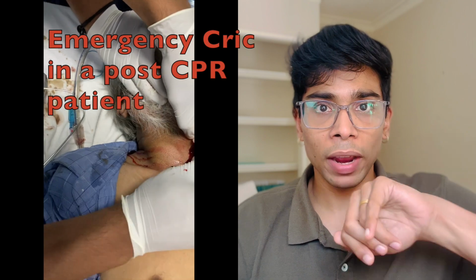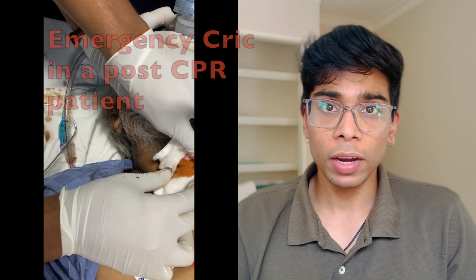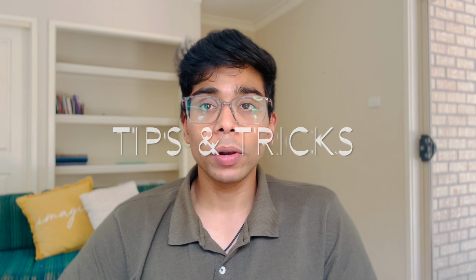So once your finger is in and you confirm that you're inside the trachea, you pass a bougie along your finger into the trachea. It's very clear. You hear the tracheal clicks, and once you've gone 2 to 3 tracheal clicks in, that is more than enough. Passing the bougie forcefully can often result in damage and perforation of your trachea, and that's not something that you want. Once the bougie is inside, you just pass the tube, railroading it over the bougie into the trachea. And yeah, you're done. You inflate the cuff, bag, verify the position of the tube, and voila, you've saved a life. There are some tips and tricks and some complications that I also like to talk about.